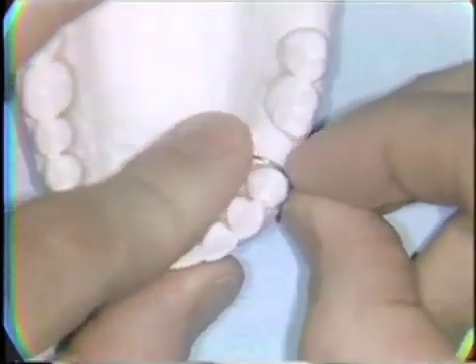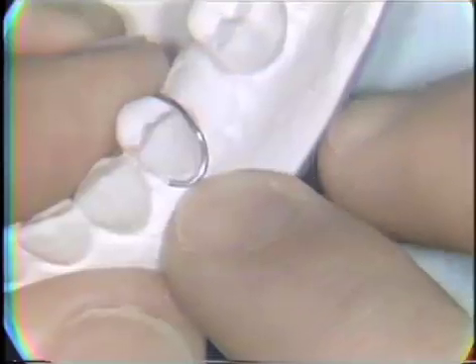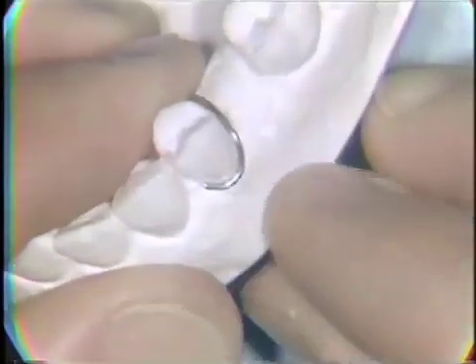The completed circumferential clasp engages the buccal undercut area of the tooth firmly, and it's adapted to run just occlusal to the free gingival margin of the tooth. The palatal extension is adapted to be approximately a millimeter off the tissues, so it can be completely embedded in acrylic.